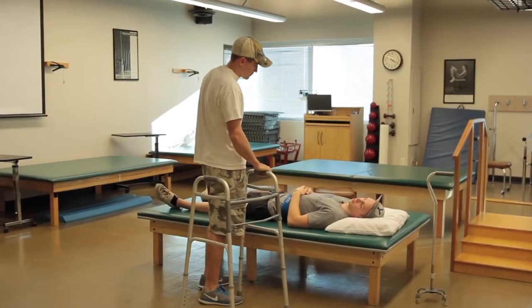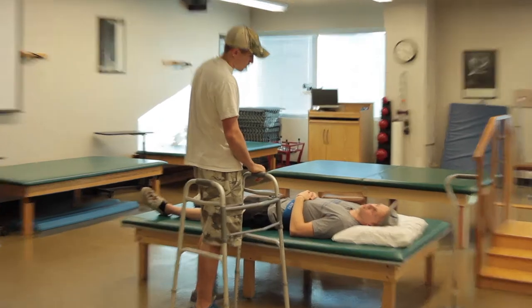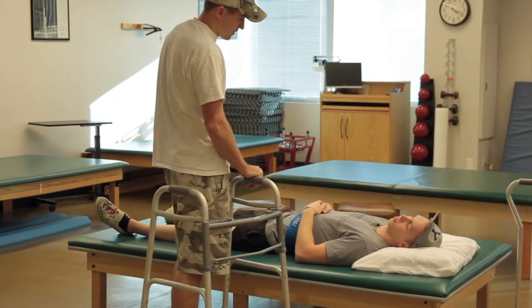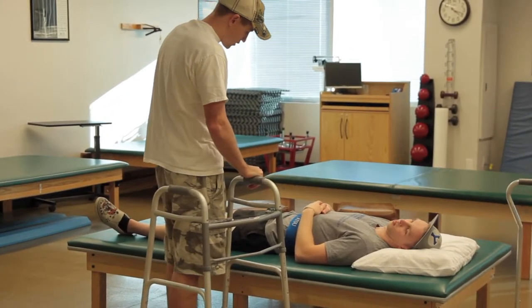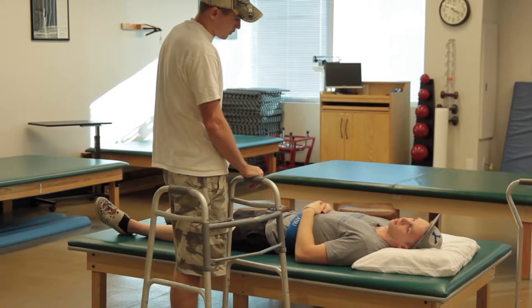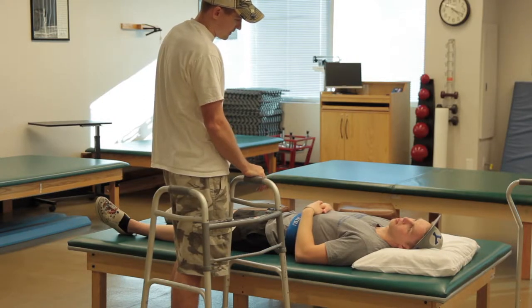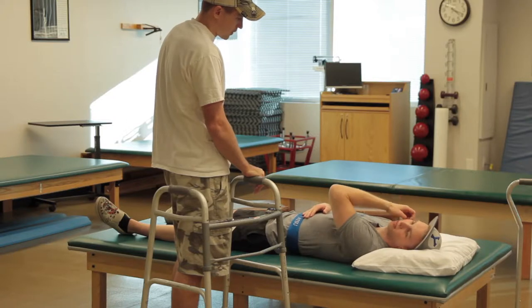Good. I'm Dylan. I'm a student physical therapist, and I get to help you walk with a walker today. Is that okay if I help you do that? Okay. So I understand you had a left posterior approach total hip arthroplasty this morning. How are your pain levels right now? It's okay. Doing pretty good.